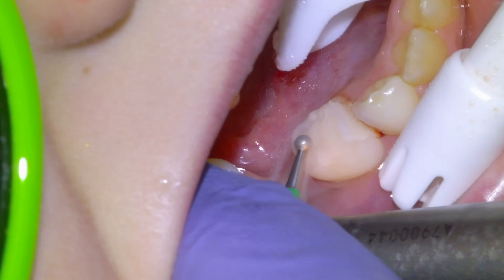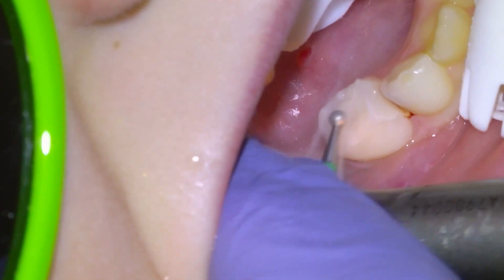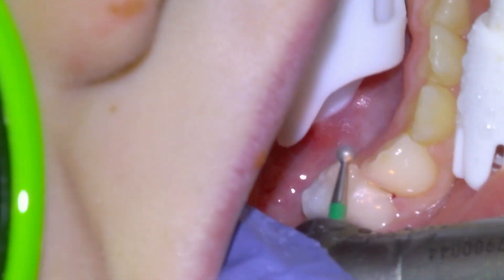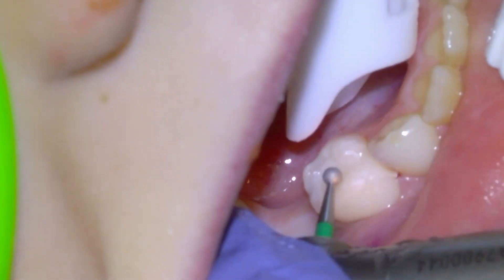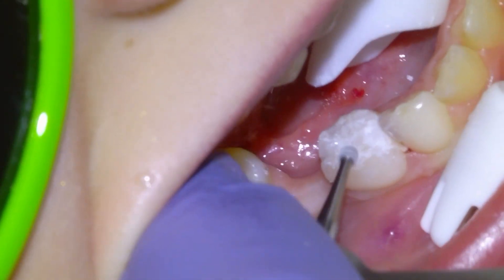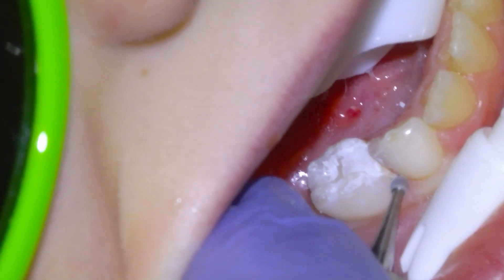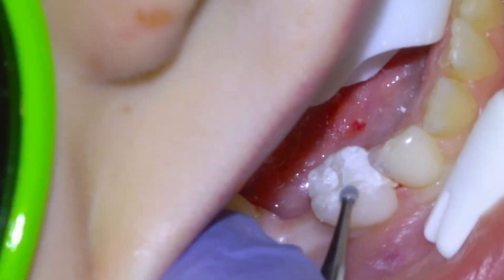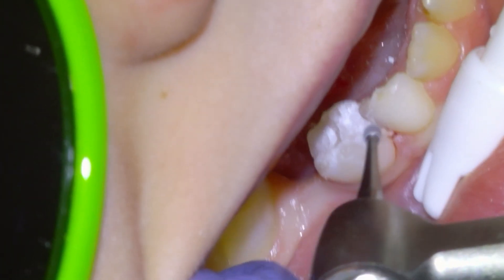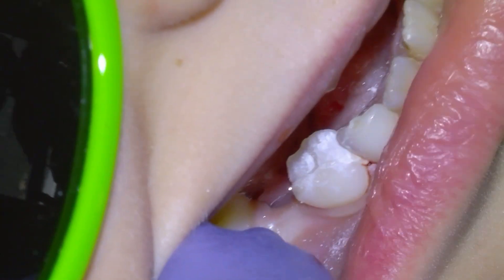Remove our Tofflemire band and then begin removing the excess restorative material with the large round diamond. This is always a rewarding type of case to do because this is a cavity that the patient was complaining of sweet sensitivity and temperature hypersensitivity, but with a restoration like this we can be almost certain that the tooth is going to be symptom-free until it exfoliates.